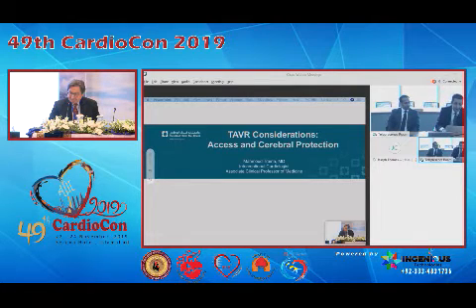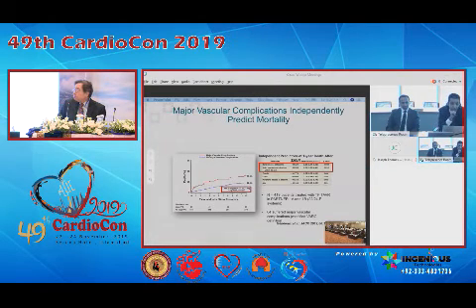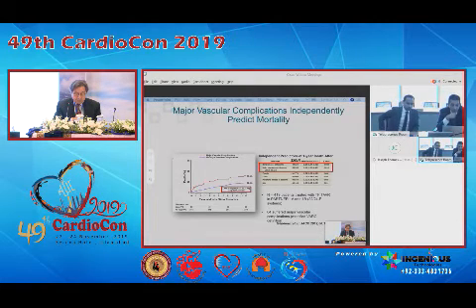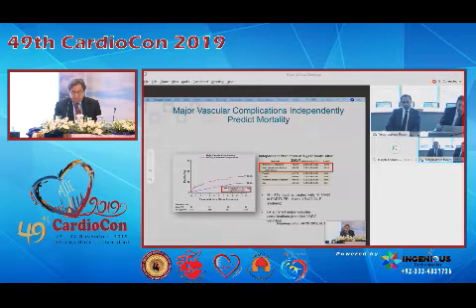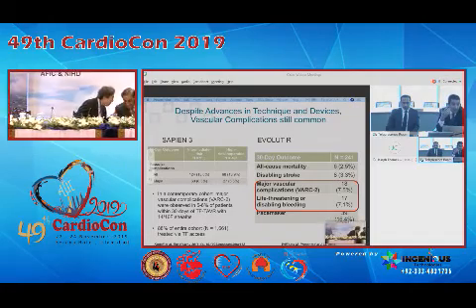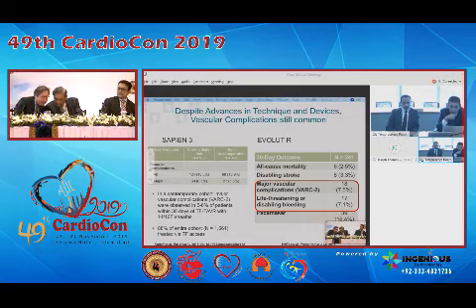All right, fantastic. So I was given this topic just to talk about access and cerebral protection. I have no disclosures relevant to this talk. So, I'll start off with the importance of vascular complications as a powerful predictor of mortality, and it's been seen in the TAVR literature from the early data to the current, and having a vascular complication is a strong predictor of increased mortality.